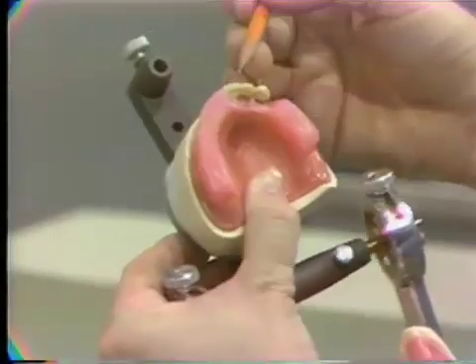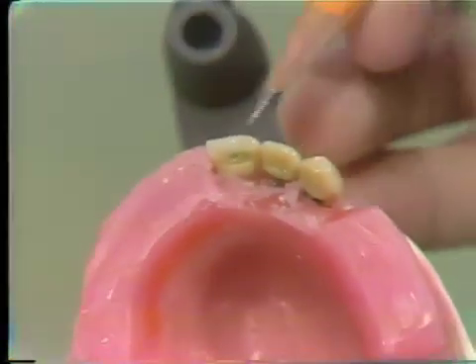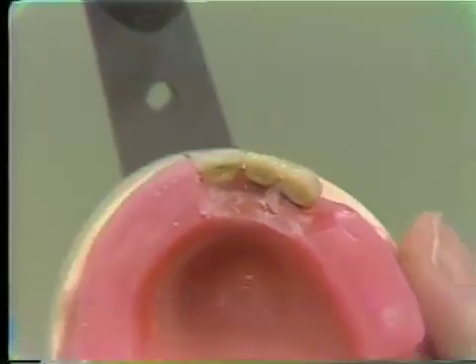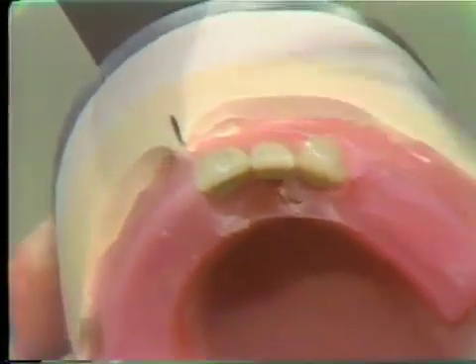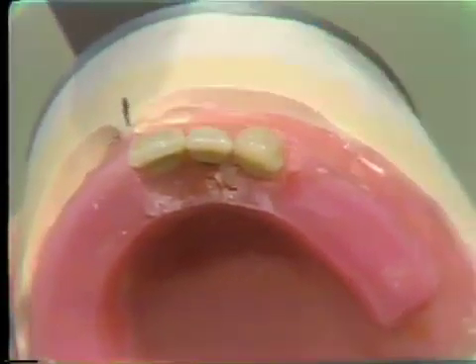And at this point you can see that the symmetry on the side where we've set the teeth matches the symmetry on the side where we still have our guide, we still have the occlusal plane. Now see how prominent the neck is of the cuspid tooth. This is characteristic. Don't depress this neck. The lateral is slightly depressed, and the labial surface of the central is in the vertical plane.